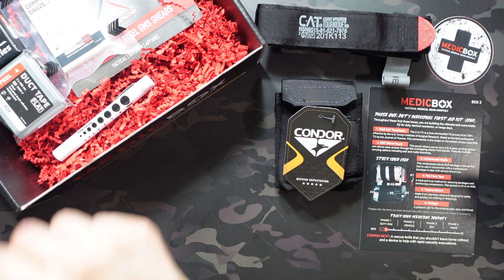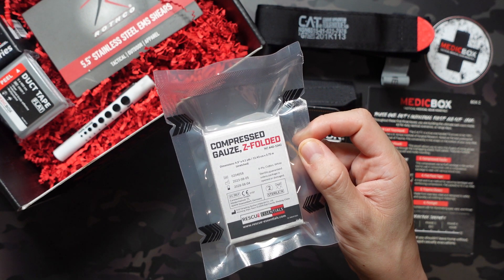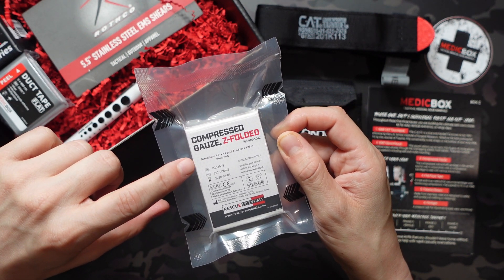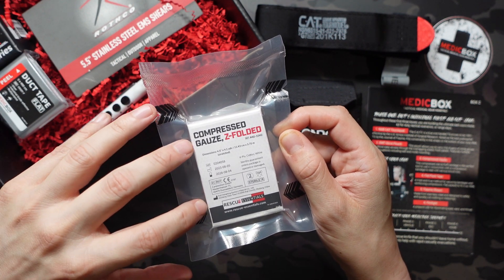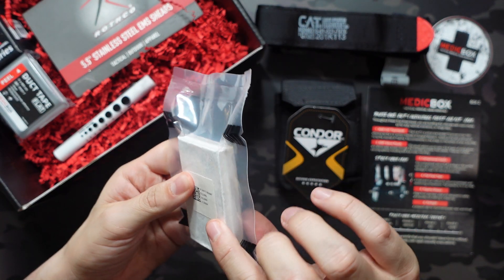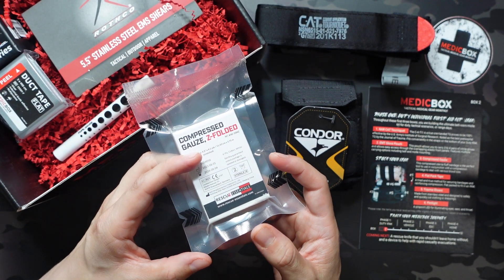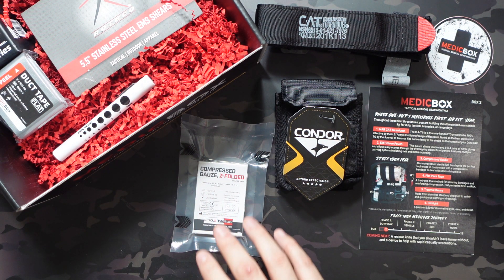Next up we have compressed gauze, Z-folded from Rescue Essentials. Not the most exciting item but definitely something you need in any first aid kit. You get 4.5 inches wide by 4.1 yards — that's 11.43 centimeters wide by 3.75 meters — stretched out fully expanded. I left this one vacuum sealed not only to keep it compact but to keep it sterile. A ton of gauze — great to see that.